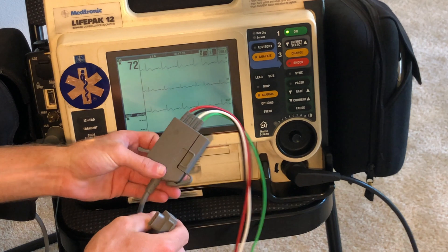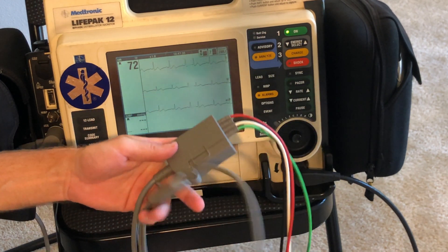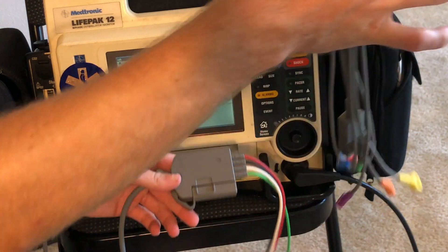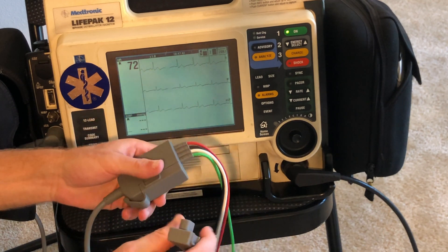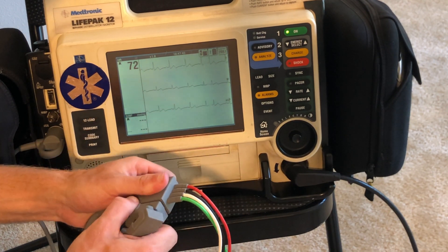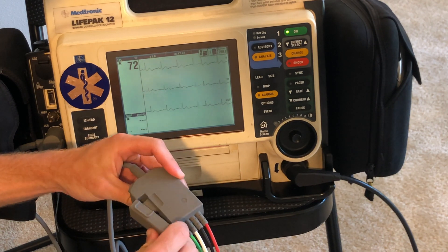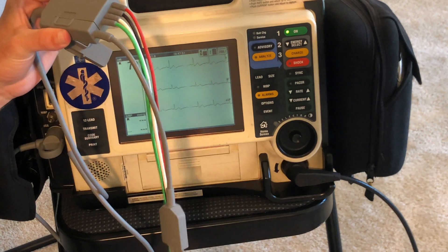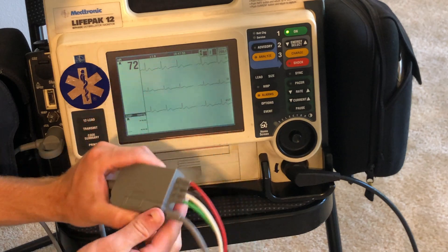So now we're going to talk about the 12-lead EKG. To show you this, I'm actually going to do it on myself. So you have your extra 12-lead cables over here. This actually connects right into the primary lead set — we take this off and connect this right in and snap it in. Now we have all the leads connected, so I'm actually going to take these leads and do a 12-lead on myself right now.